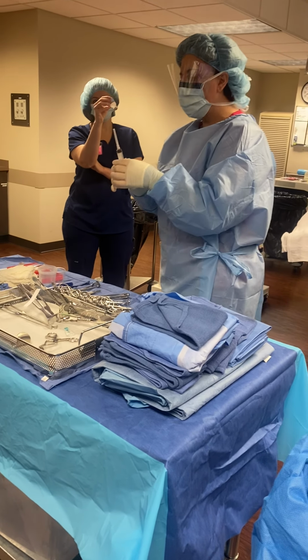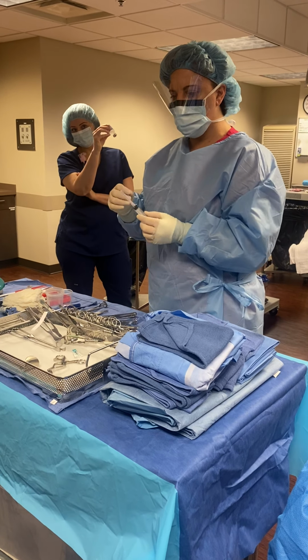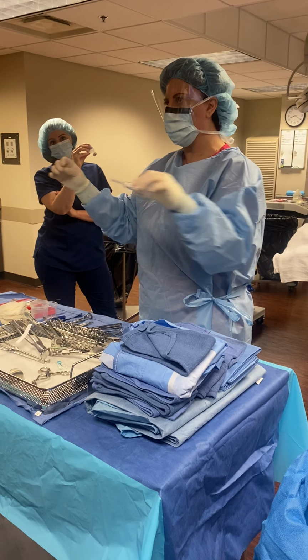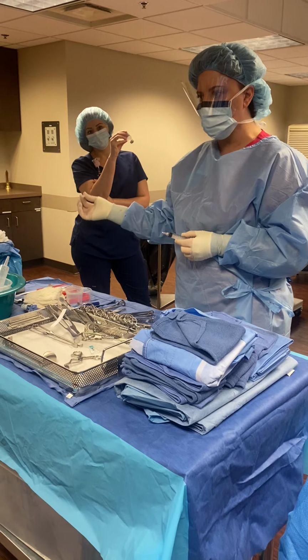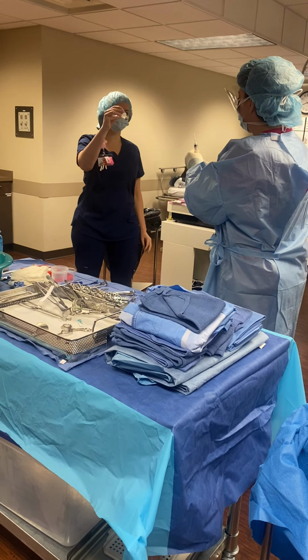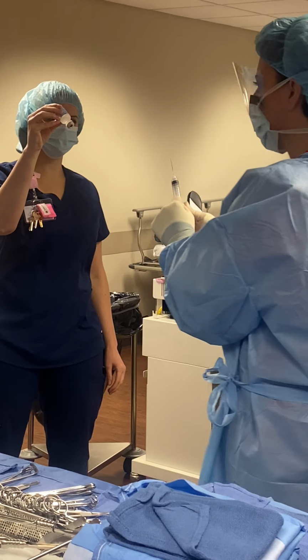Okay, so when I remove a cap from the hypodermic needle, I typically just lock one arm in and then go with the other arm, because if you do both at the same time, there's that recoil thing. So I just feel safer doing it this way. And then you want to draw about a mL up in your syringe and be looking at your numbers, right? You want to fill it to capacity.